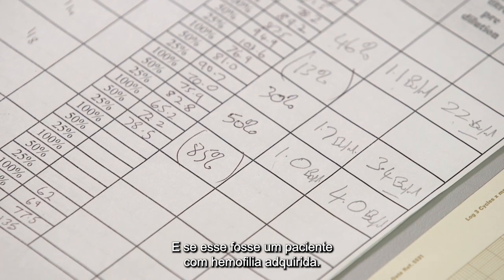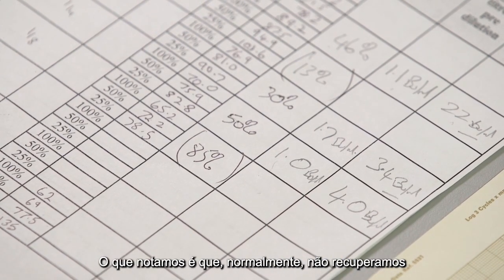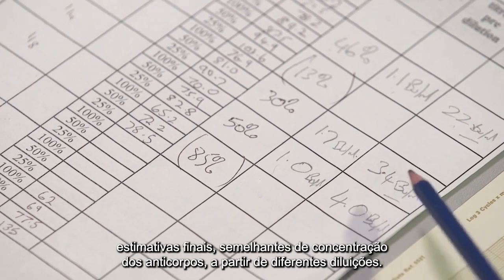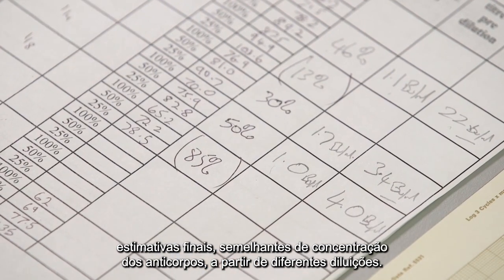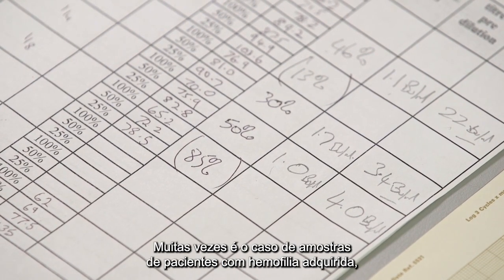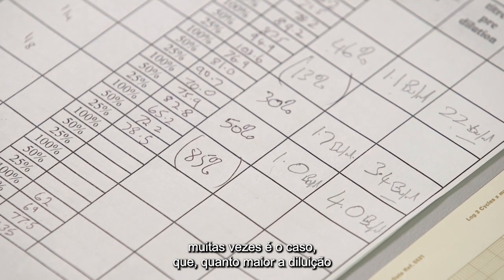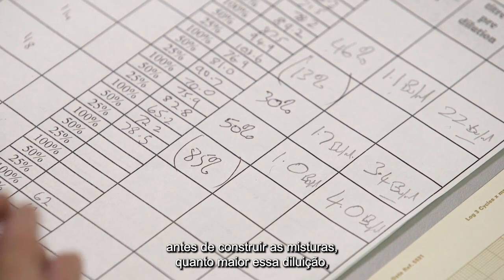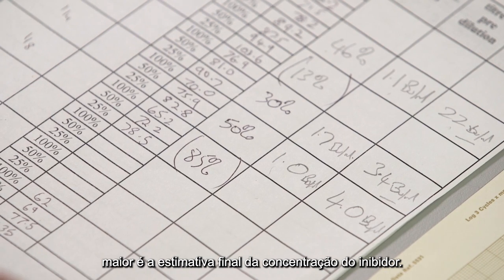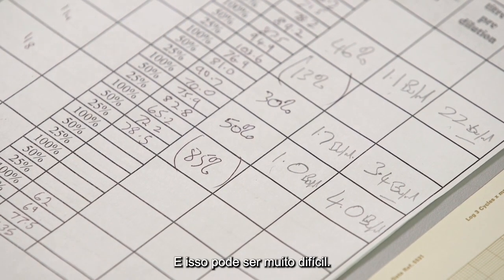If this were a patient with acquired haemophilia, what we notice is fairly typically we don't recover similar final estimates of antibody concentration from different dilutions. Actually quite the reverse. It's often the case for samples from patients with acquired haemophilia that the higher the dilution before constructing the mixtures, the higher is the ultimate estimate of inhibitor concentration. And this can be very difficult.